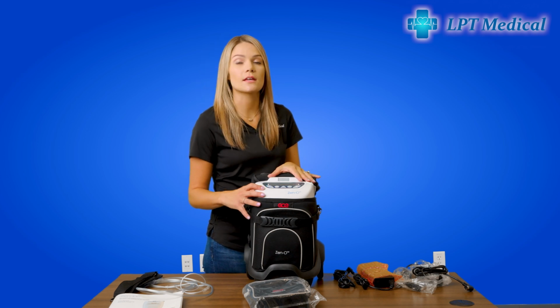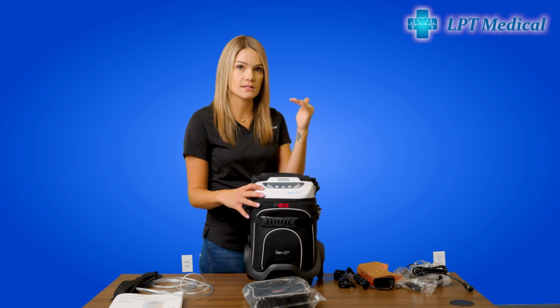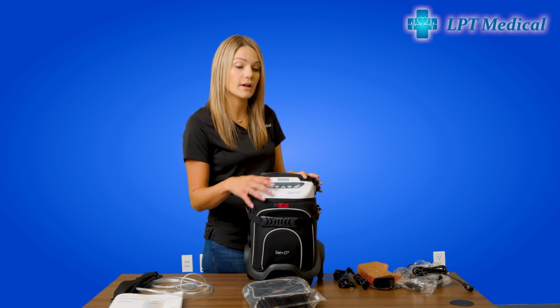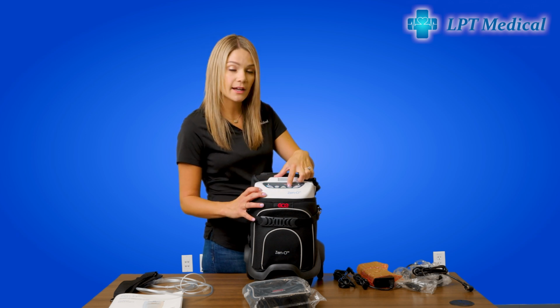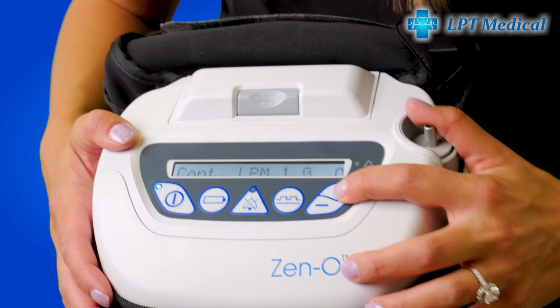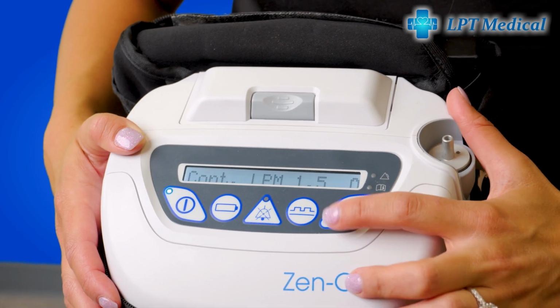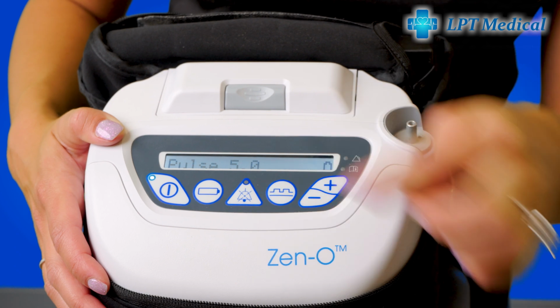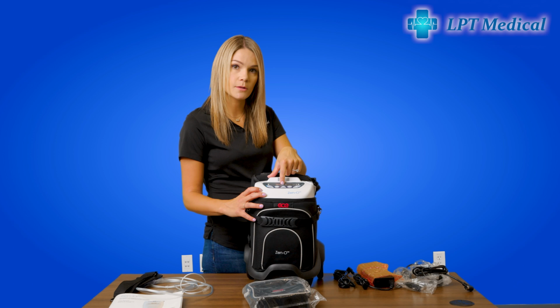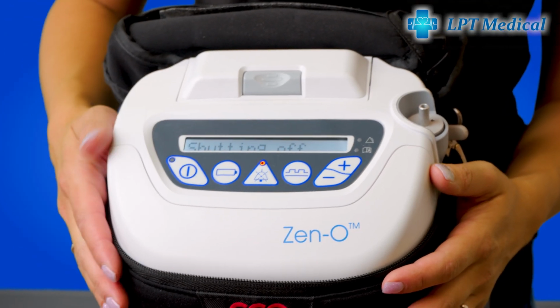And this unit does a pulse setting of 1 to 6. It also goes up in half settings as well. And it also does a continuous flow of 1 to 2. You can easily switch back and forth with this button and adjust your settings with these buttons. Plus to go higher, minus to go lower, and again this button to go back to pulse flow. And then there is also a bell button to silence any alarms that it may have. And then to power it down, simply hold the power button again.